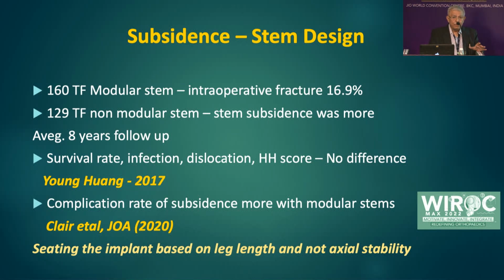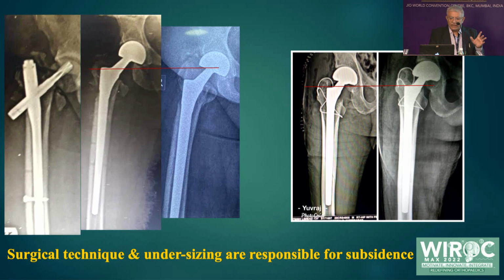Subsidence is a main issue on which there was debate, but the literature is quite differing. Seating the implant based on the leg length and not the axial stability is what we have to look into. And it is a surgical technique issue, in which undersizing is responsible for subsidence.